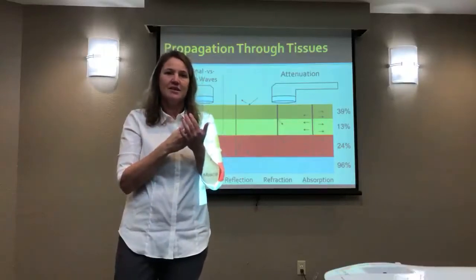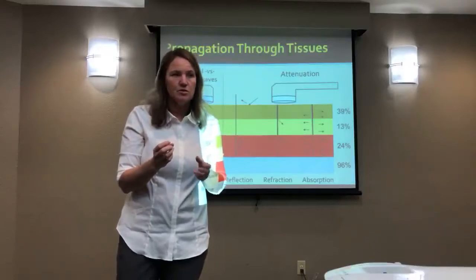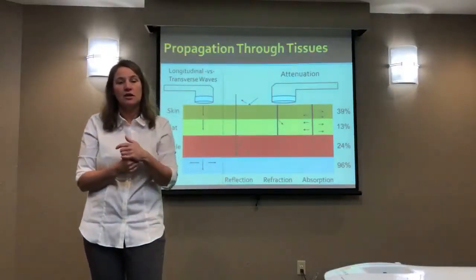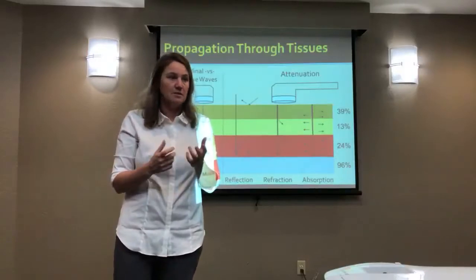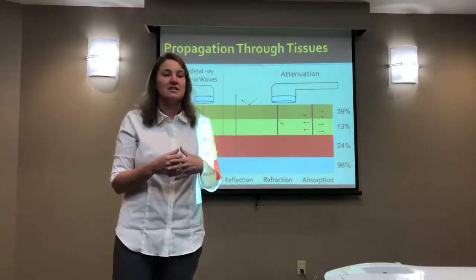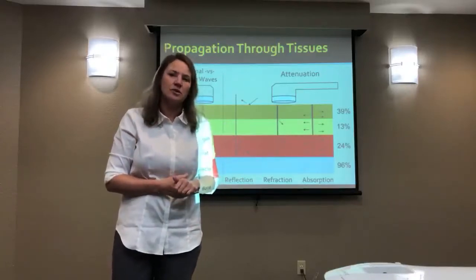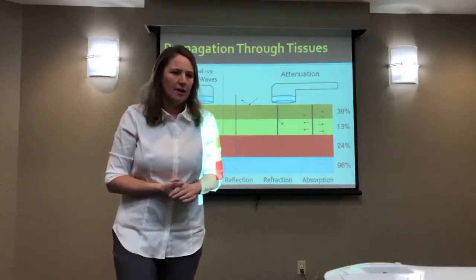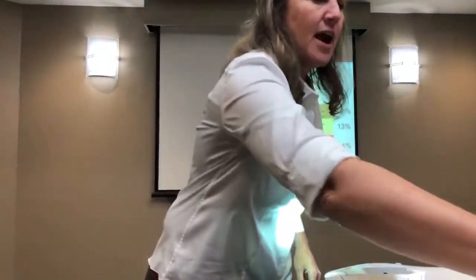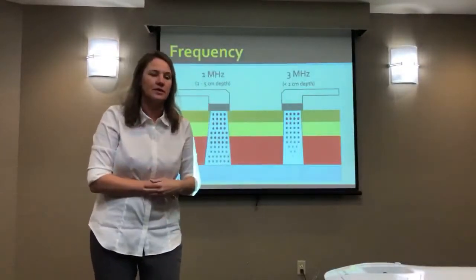thin skin, mostly some adipose tissue, and not a lot of muscle. So thinking about could I get to a target isn't just the centimeters of depth, it's how many centimeters of what, and is it acting more like a solid, is it more of a muscle? That's gonna really help dictate whether you think you can achieve it or not. Okay, so that's the idea of how it goes through the tissue and how the energy gets distributed.